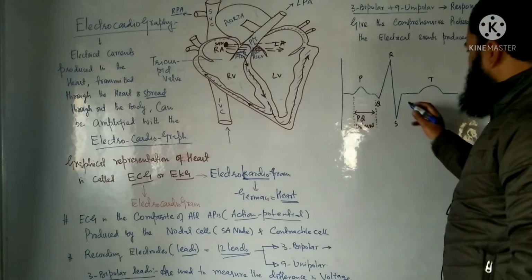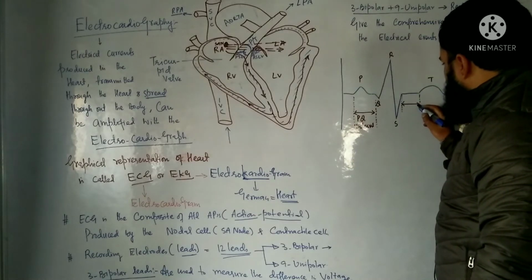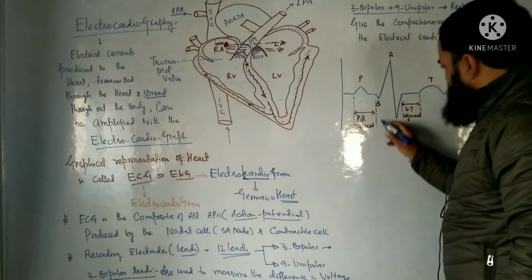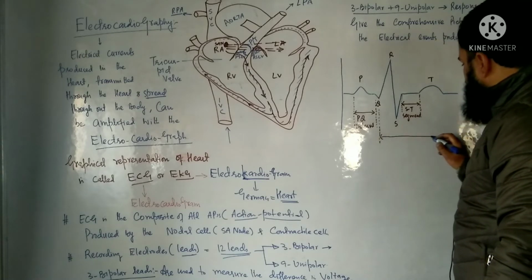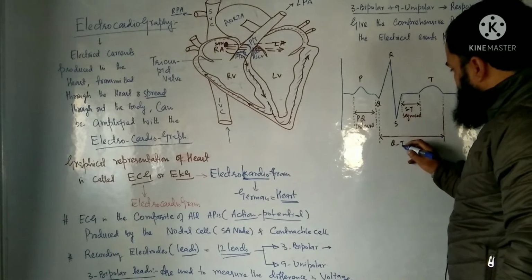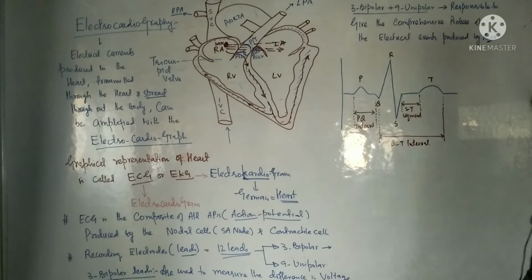Then here is a segment, which is here and here. This is called the ST segment. And from Q up to the end of the T, this is called the QT interval. Now, I will discuss them one by one.